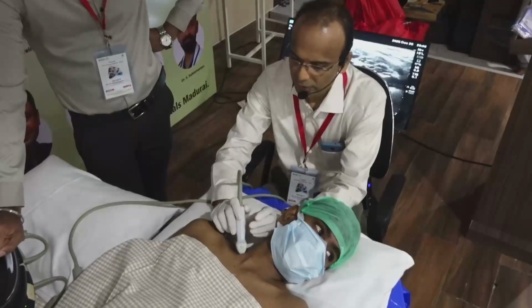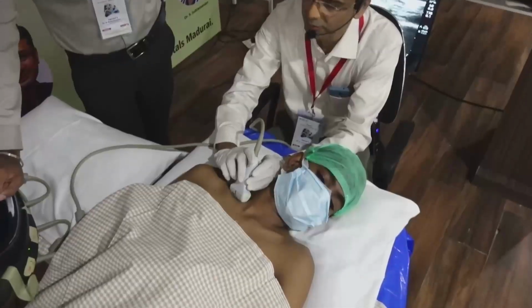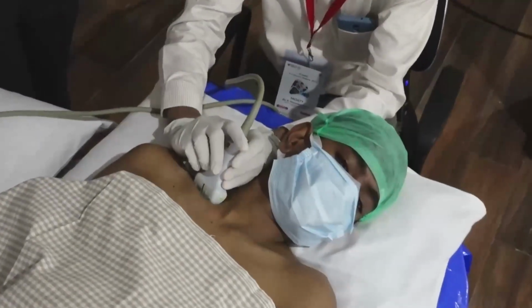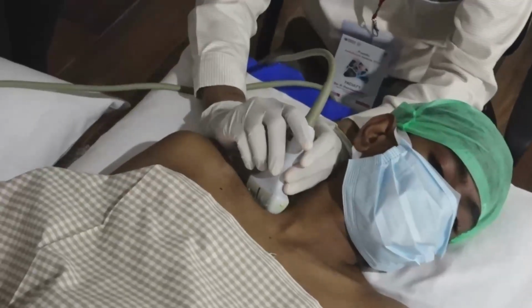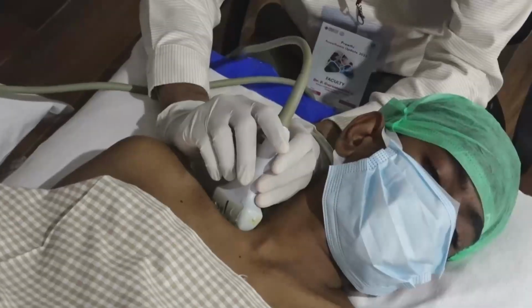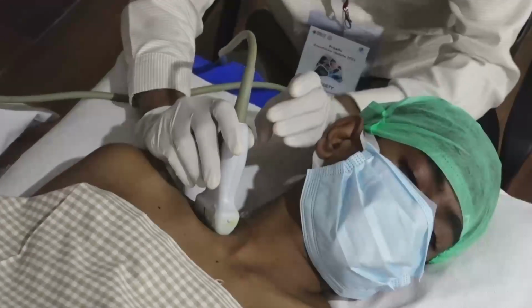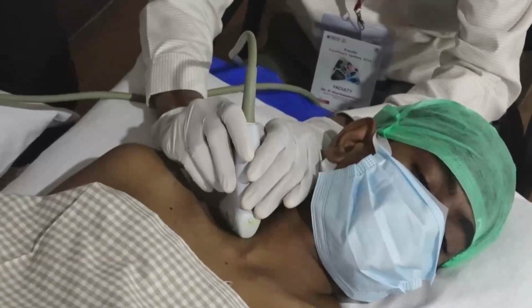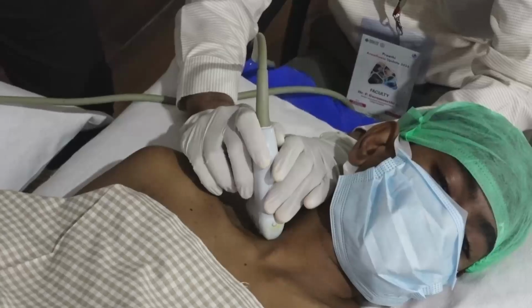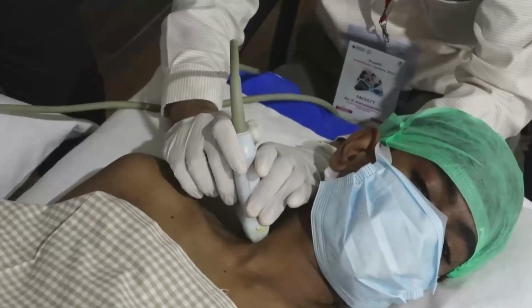So now we'll start with the elements of the brachial plexus, again from the subclavian artery, and next to that we are seeing that bunch of grapes. Sorry, here we don't see roots, here we see trunks and divisions. As we move on, we see elements of the brachial plexus in the interscalene groove.